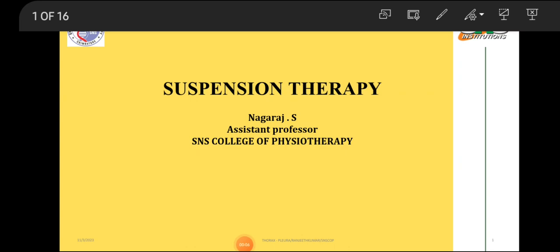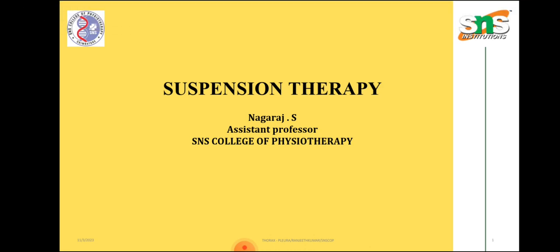Suspension therapy is one of the therapeutic modalities. It is used to eliminate gravity during motions. It is mainly used for muscle power of 0 to 2. Muscle power of 0 to 2 goes for this treatment technique, and after grade 3, the patient moves on to resistance training.